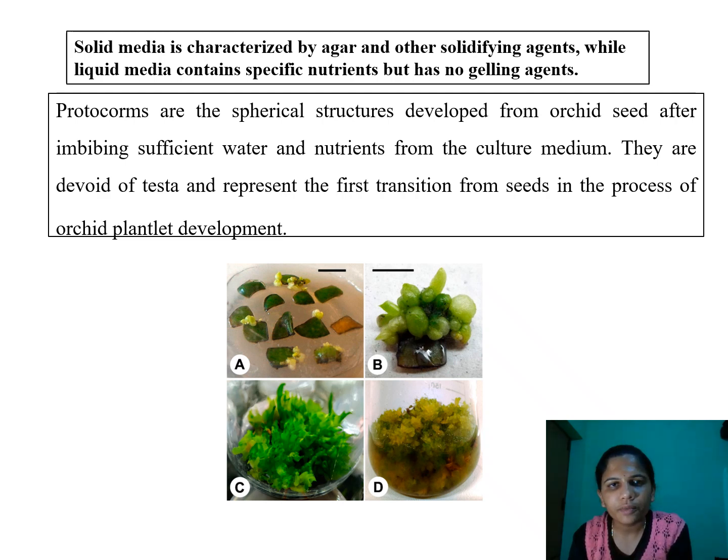they are all using ready-made medium only. Ready-made medium is easy, so we can avoid the problems while weighing, and also we can avoid inaccuracy and other things. It is easy compared to the normal or conventional method of preparation.